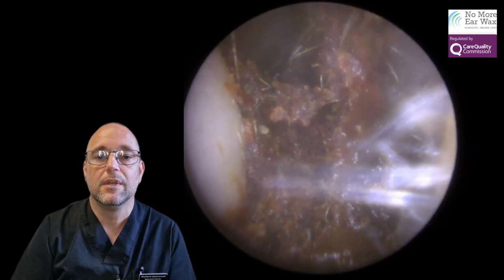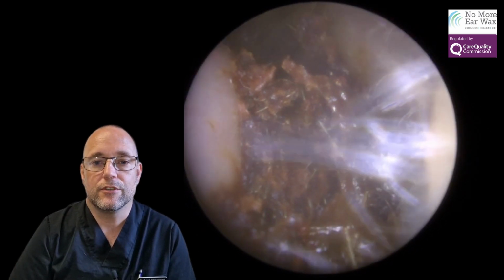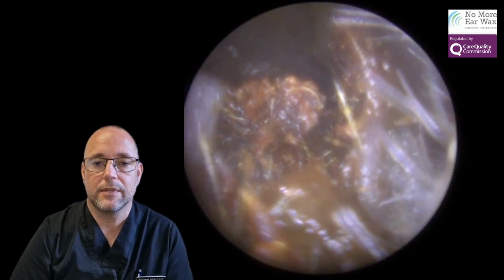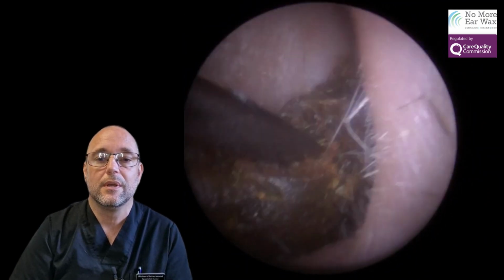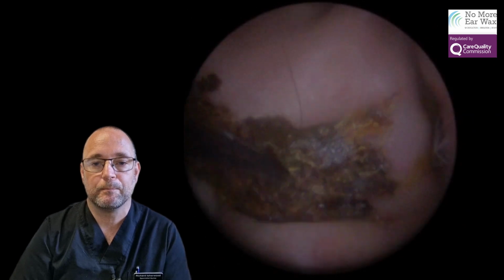Obviously you have to be careful, because if you break through it, you don't want to catch the ear canal in any way. But we're very close to the outside here. So it's perfectly safe to do it. And look at this, it's just about to come. And what a monster it was. Look at that.